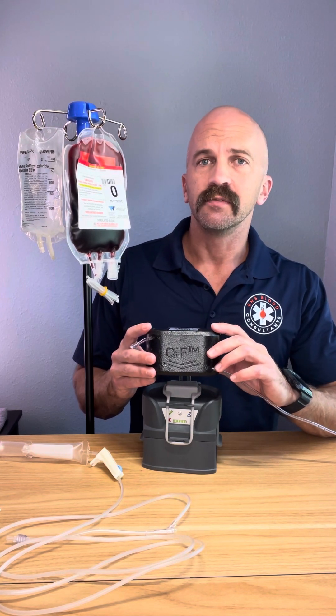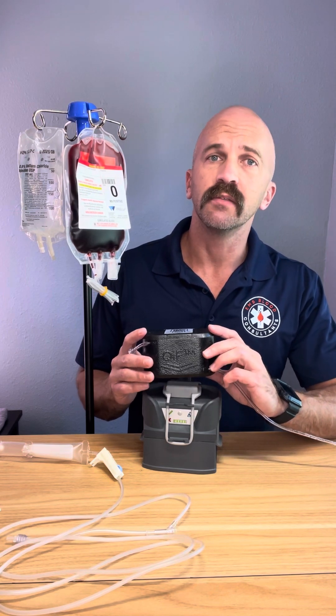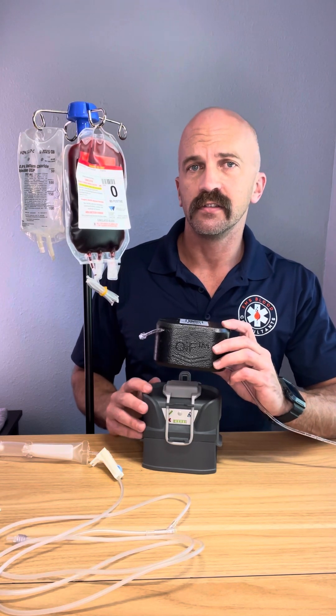It can actually heat up to 200 mL per minute as far as the flow rate. So if you need to get blood in quick, this is the unit to go with.